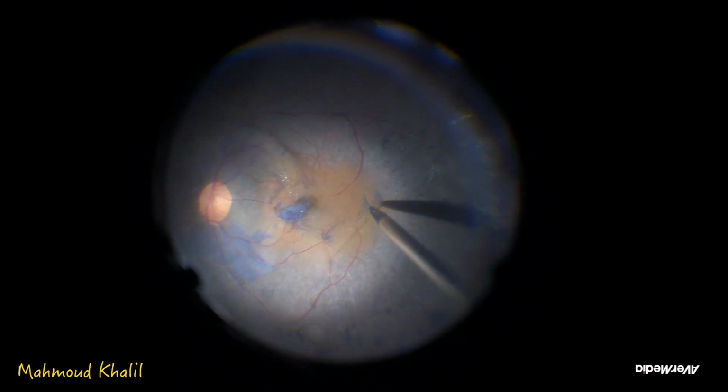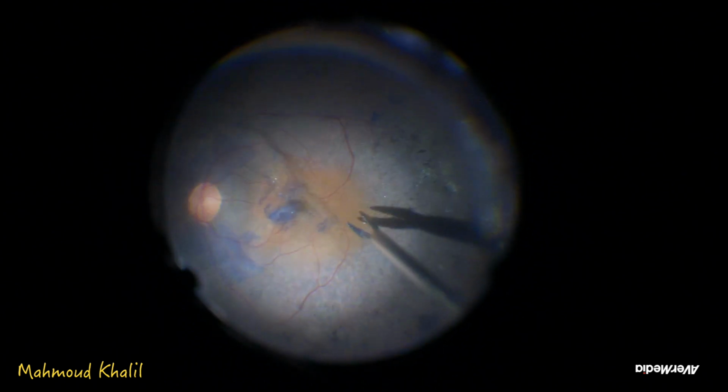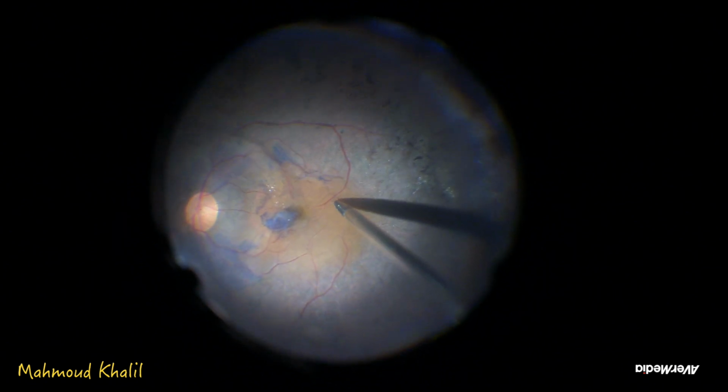Doing a fovea sparing PVD, and also later on doing fovea sparing epiretinal membrane and ILM peeling, preserving the center of the fovea. In these cases, we hope to keep the central vision because the patient has lost the peripheral vision.